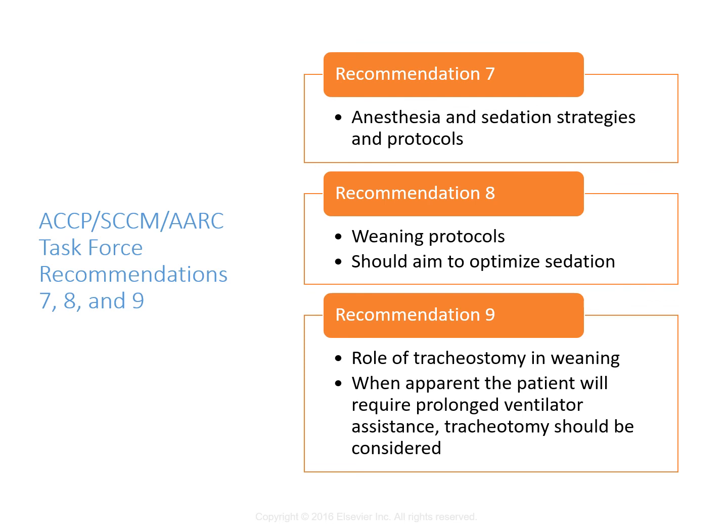So usually within 7 days of onset of respiratory failure or sooner in neurosurgical patients, they might benefit from having a trach earlier than later. Then they might have less days in the ICU, less days on the ventilator, less risks associated. So high levels of sedation are usually required for endotracheal tubes, but less are usually required for tracheostomy tubes. Patients with marginal mechanics that have tachypnea might actually do better with the tracheostomy tube. It has lower airway resistance than an endotracheal tube. Right? So that's a big advantage.